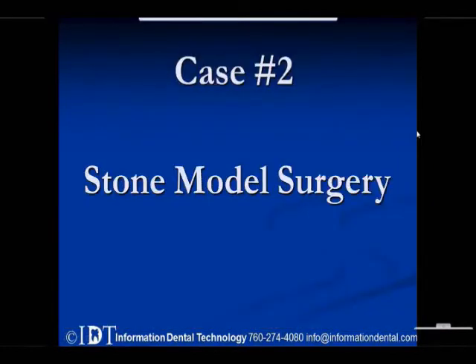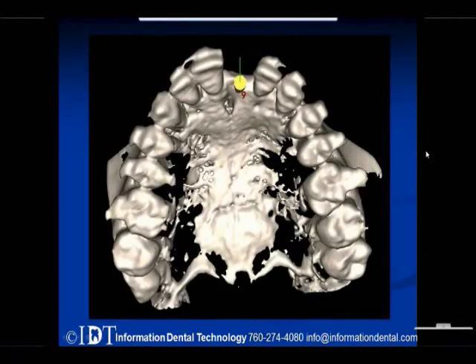Okay, case number 2. This is stone model surgery. And this one, as I said, I feel like this one's one of the more accurate out of the 3. But not all patients are a candidate. What makes a patient a candidate for this is the ability to see the occlusal surfaces. We have to be able to see the incisal edge. We have to be able to see every cusp and groove pretty clearly, because what we do is we take a model and we merge that with the scan.